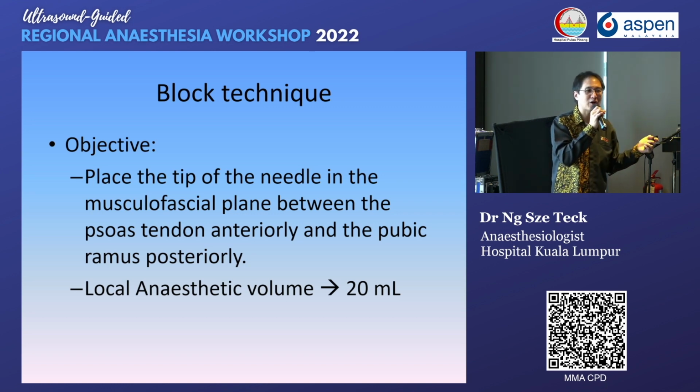Like I said, this block was introduced in 2018, so we actually still don't know, but the case series that they introduced typically use 20 cc, and they find that it works.